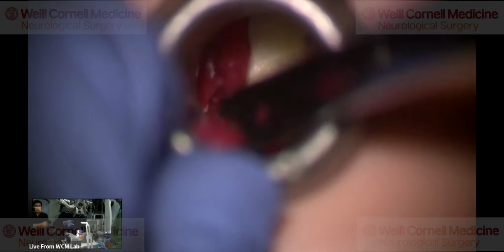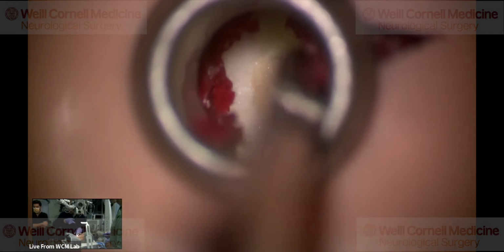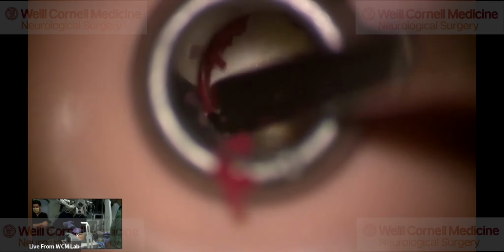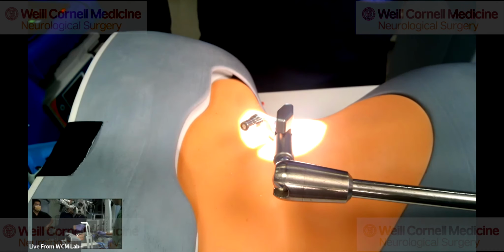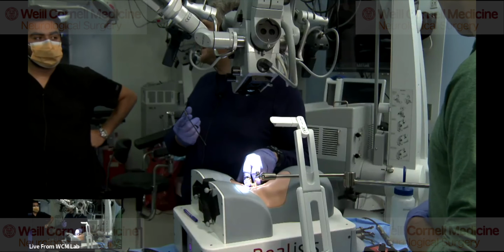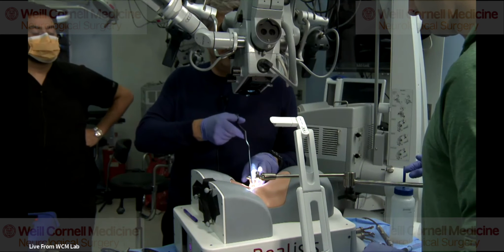In those patients I go ipsilateral, contralateral, ipsilateral, because I don't want to risk falling into a hole and hurting the spinal cord. But in these cases, if you do multi-level cervical foraminotomy on the same side, then I would dilate all levels first. For 2 levels, sometimes you can stay within the same opening, but usually I try to dilate separately before I do any of the bone work.